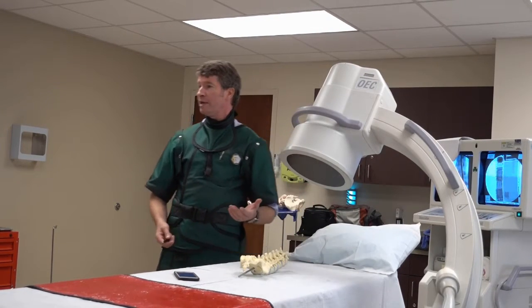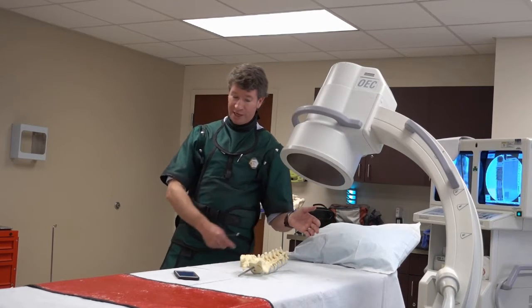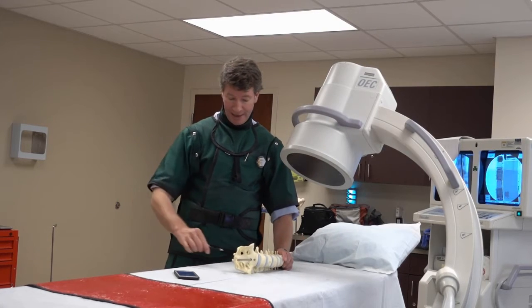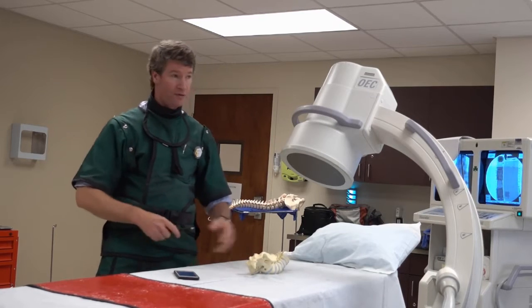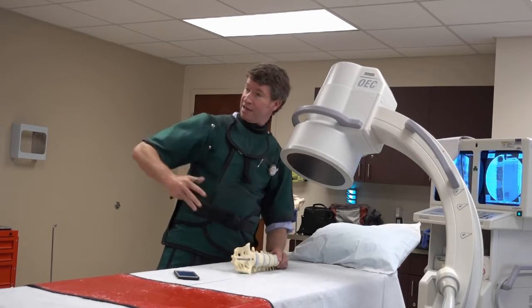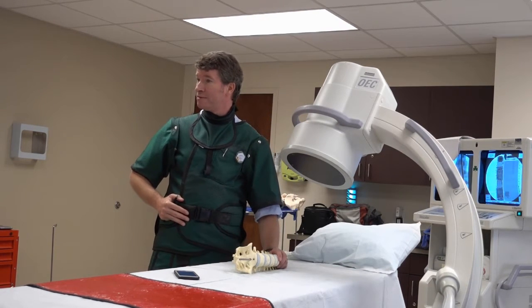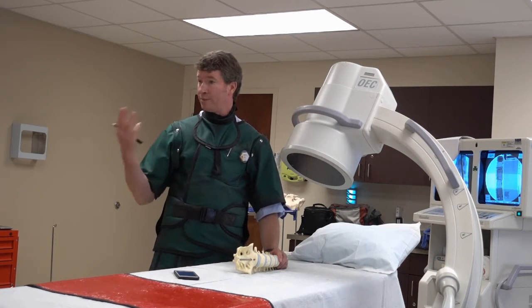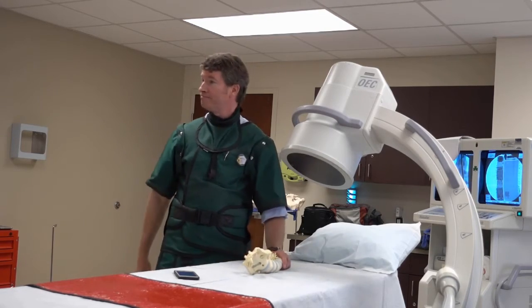And generally speaking, when we put in a pump, it's the left side of the patient that goes down because 90% of people are right-handed. I'm going to be using my right hand as I put the needle in the spine. I don't necessarily want to be using my left hand. So it's easier for me to use my right hand, so that means the left side of the patient down. That means the right-hand side of the belly. So if you look at most pumps, they're almost always in the right belly because that's where it's big enough to place it. And if you go to any other practice, it's about the same unless you've got a left-handed doc, and a left-handed doc probably puts it on the other side.